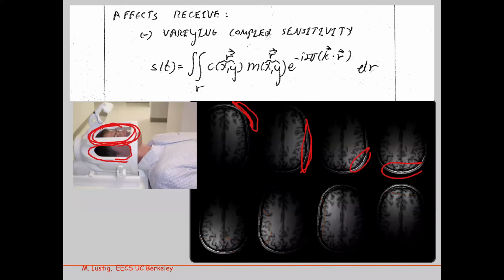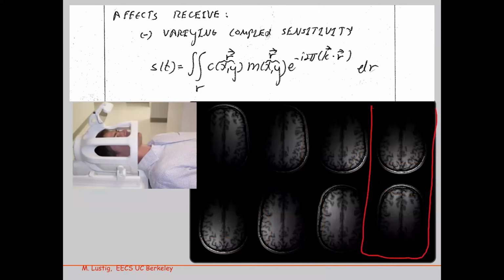The other thing I just want to mention briefly is that there's another consequence. I just want you to look at those two images. The image above, I can say, is a pretty nice image up to here, and the rest is almost black, right? And this image over here is pretty good, but the rest is black.